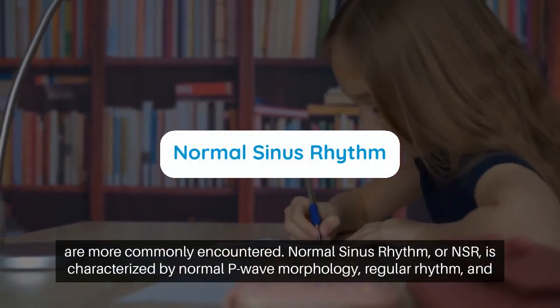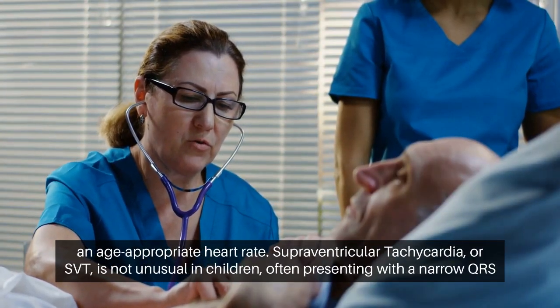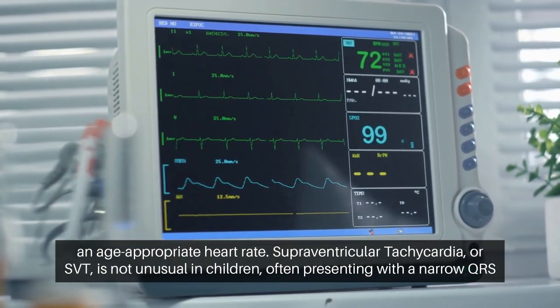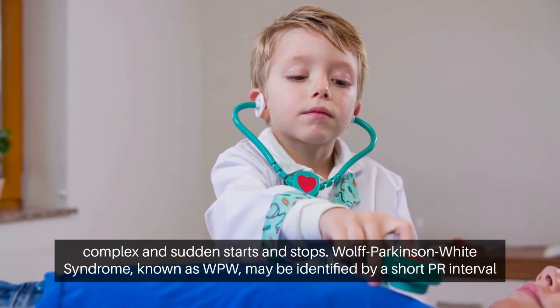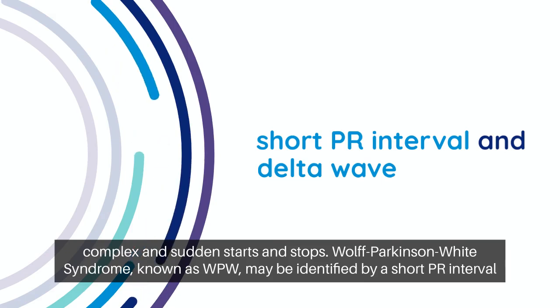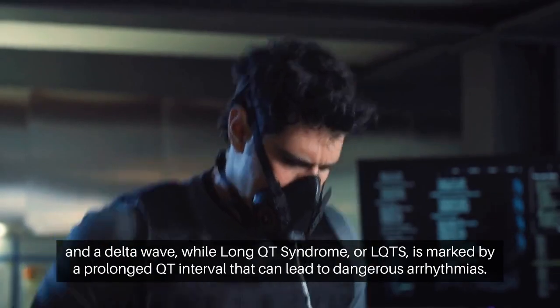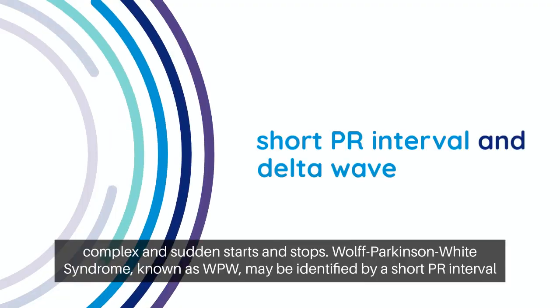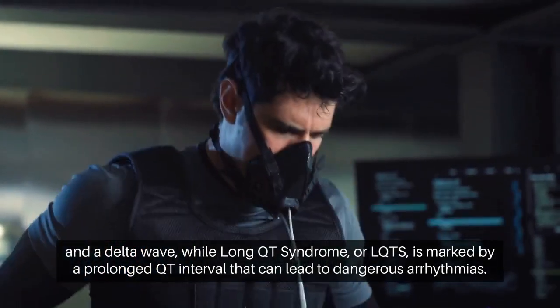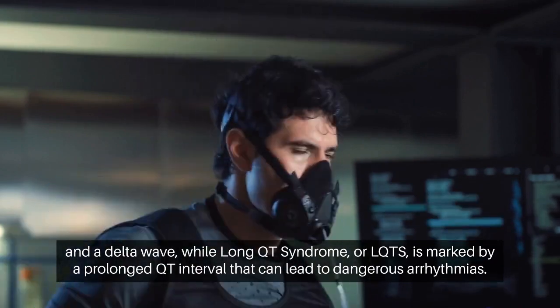In the realm of pediatric ECGs, certain rhythms and patterns are more commonly encountered. Normal sinus rhythm, or NSR, is characterized by normal P-wave morphology, regular rhythm, and an age-appropriate heart rate. Supraventricular tachycardia, or SVT, is not unusual in children, often presenting with a narrow QRS complex and sudden starts and stops. Wolff-Parkinson-White syndrome, known as WPW, may be identified by a short PR interval and a delta wave, while long QT syndrome, or LQTS, is marked by a prolonged QT interval that can lead to dangerous arrhythmias.